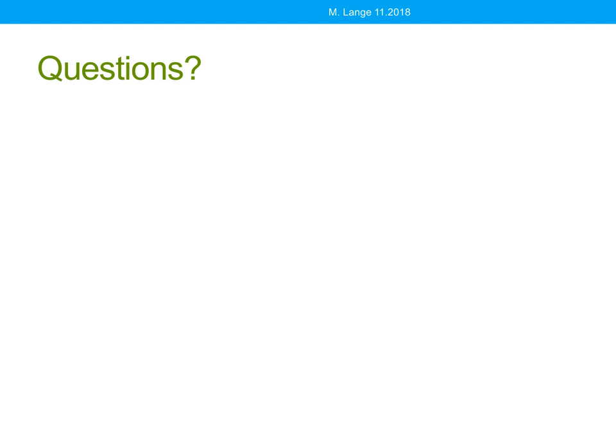Oh, and Allison, thank you for giving me a little more information. Allison has said, sorry, my question was cut off. How do you determine when it is appropriate to advance to two switches from one switch training? That's a great question. It brings up something tricky in this whole world of switches. There are lots of folks out there who would say everybody should use two-switch scanning. There's some folks who would say everyone should use one-switch scanning, and there's a bunch of us in the middle. I've got to tell you my own bias, I use one-switch scanning far more than I use two-switch scanning. But that's me, and that is the clients that I work with.